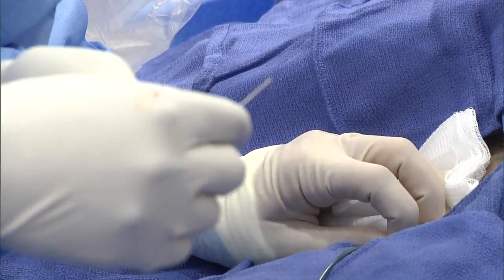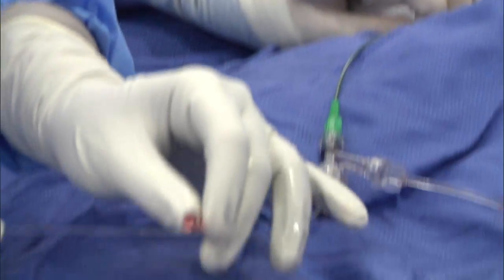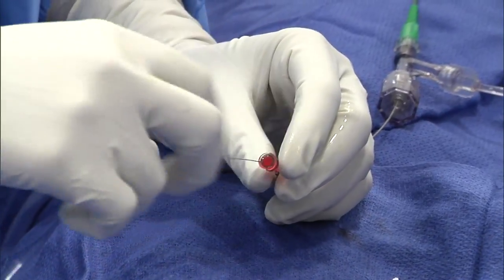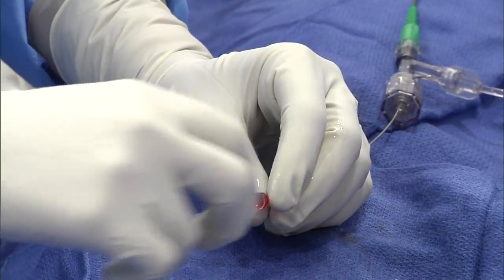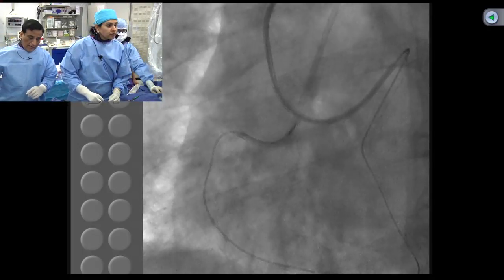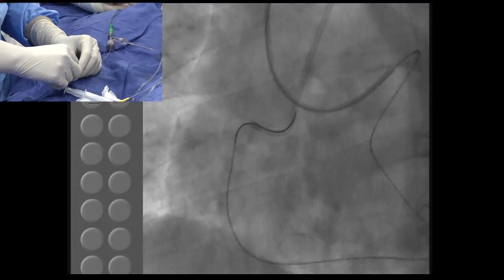Samin, except for a rare patient who may be looking at some non-cardiac surgery, no role for bare metal stents in a CTO. Absolutely. Particularly in the CTO, as you mentioned, for non-cardiac surgery, those cases probably should be able to go through surgery and then come back for intervention.